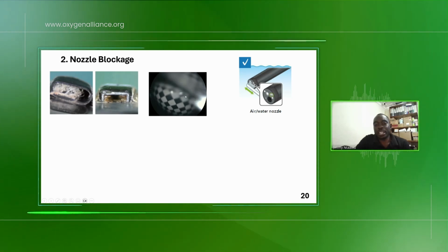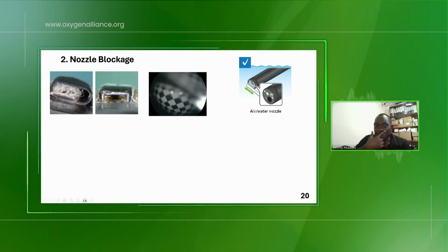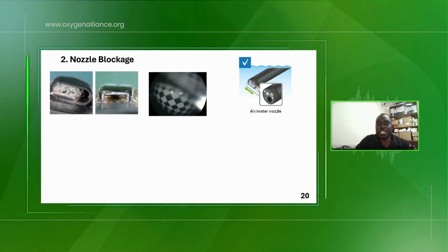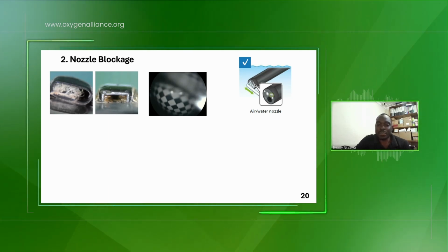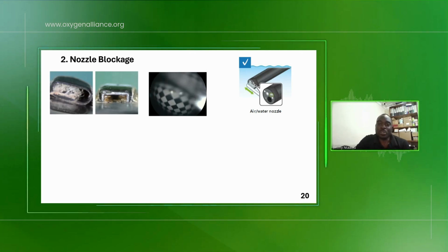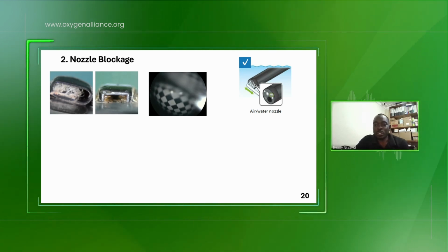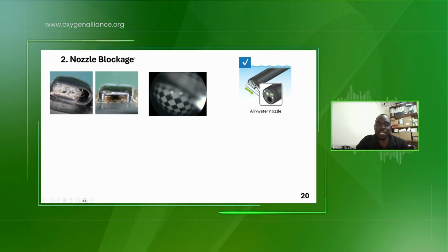Remember, the nozzle is supposed to clean the camera, but now it cannot. When you enter the patient, all the dirty fluid settles on the camera, and you won't be able to see. Some doctors choose never to do a procedure when their air-water nozzle is blocked, for fear of missing any problem that may be inside the patient.